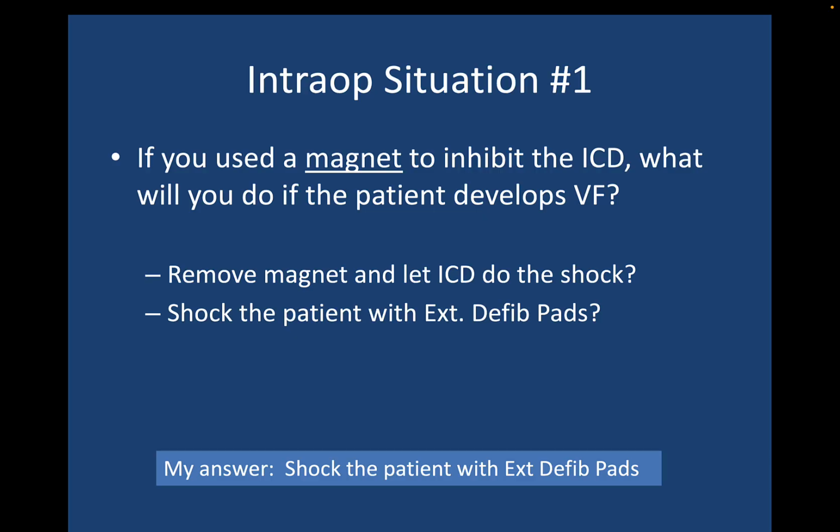What I typically would do in this scenario is I want to shock that patient immediately. I probably would take the magnet off, but I'd also defibrillate with the external defibrillatory pads. I wouldn't wait that 15 to 20 seconds, I would just shock the patient.